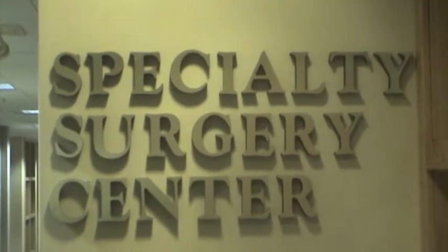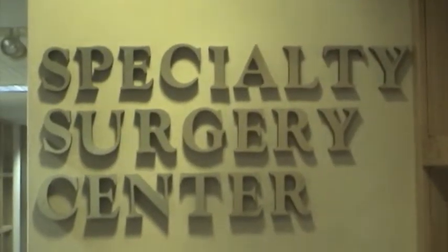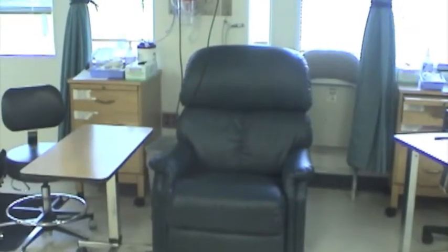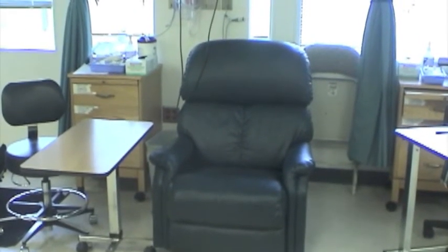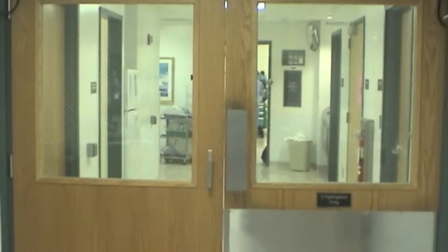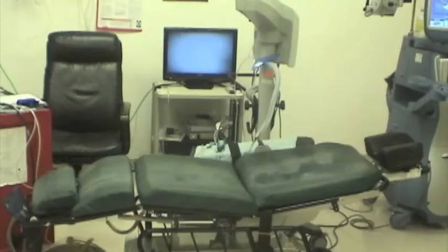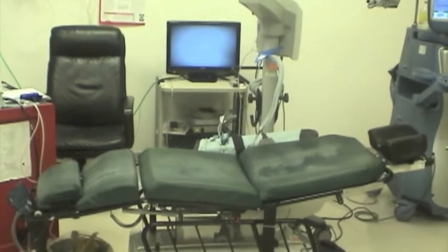The surgical procedure will be viewed shortly, but let's go through the process on the day of surgery. You will arrive at the surgery center at your designated time. After being admitted, you will sit in the preoperative area where you will receive eye drops to dilate your pupil. When it is time for your surgery, you will be transported to the operating room and placed on a stretcher so your eye can be prepped for surgery.